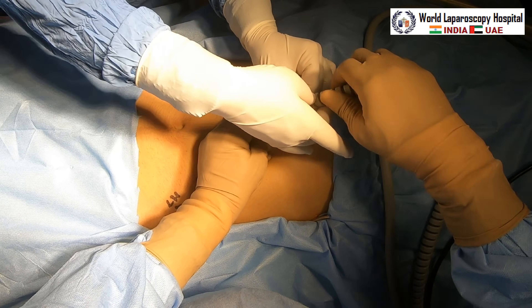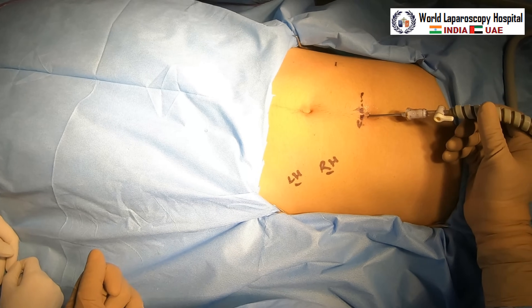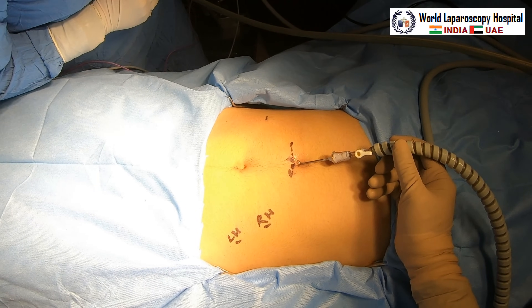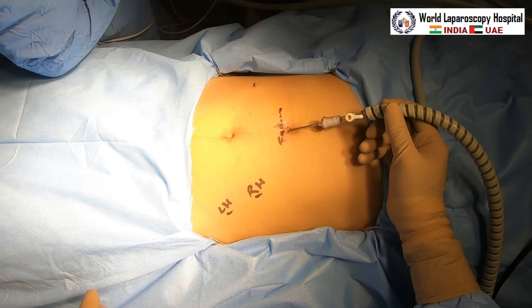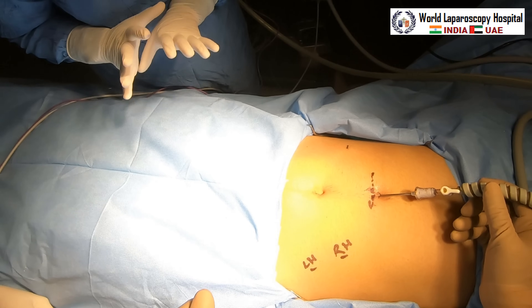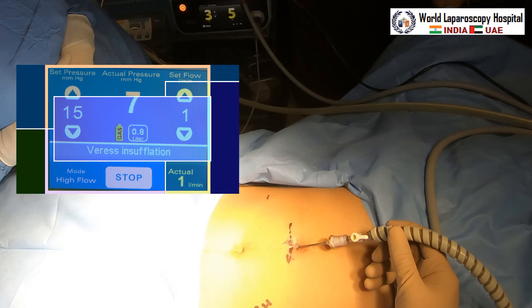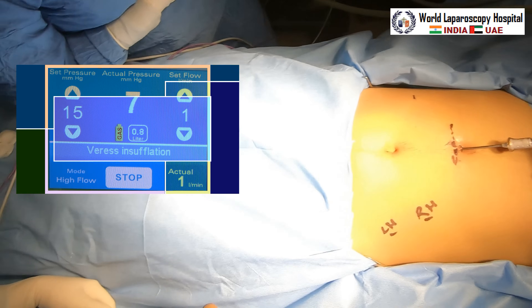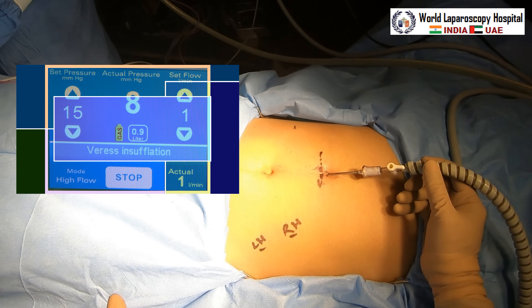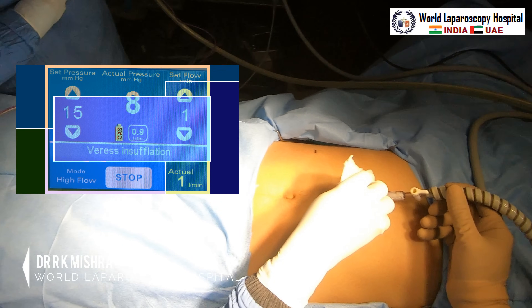Now the gas will be introduced and pneumoperitoneum started. Pneumoperitoneum takes a little time because the blood collected inside may take some space, so you have to be careful. Flow rate is kept at one liter per minute initially, and pressure is kept at 15. You can see the insufflator — pressure is at 15, flow rate is one liter per minute, and actual pressure is currently increasing. Right now, 0.9 liters of gas have gone in and actual pressure is 8.